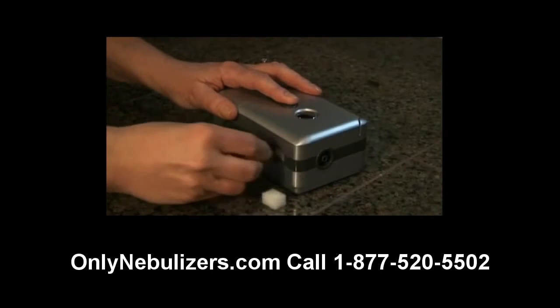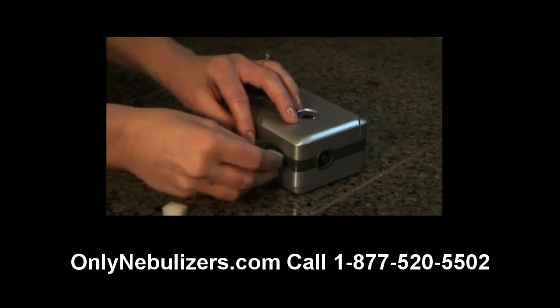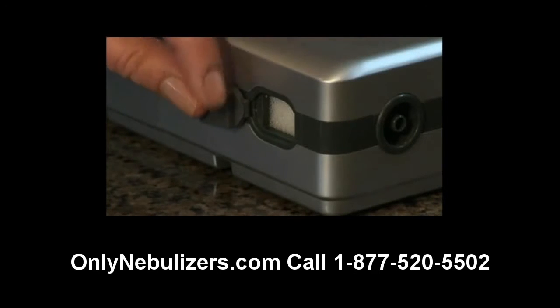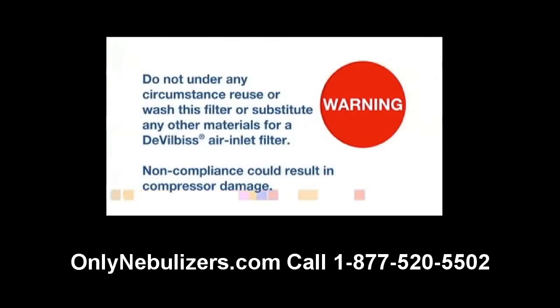To replace the filter, simply pull back the rubber cover tab on the side of the traveler, remove the filter, and then replace with a new filter. Please note that the traveler filter cover tab should remain attached to the traveler and should not be entirely removed. Do not under any circumstance reuse or wash this filter or substitute any other materials for a DeVilbiss air inlet filter. Non-compliance could result in compressor damage.